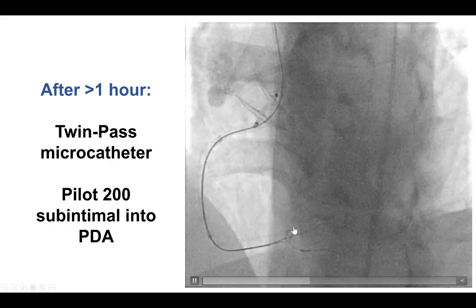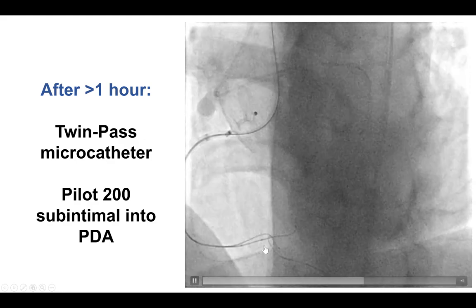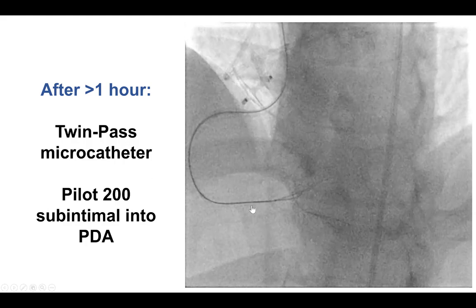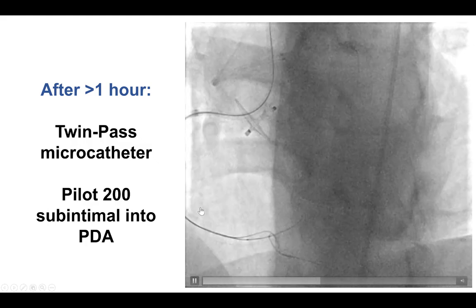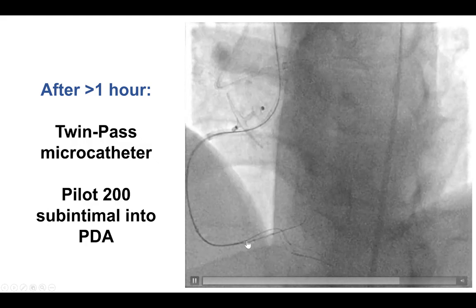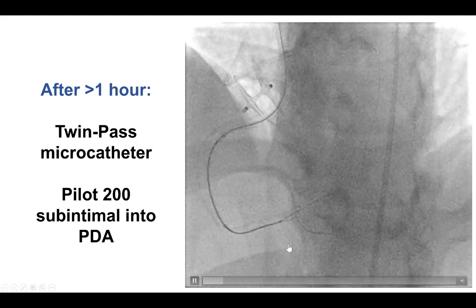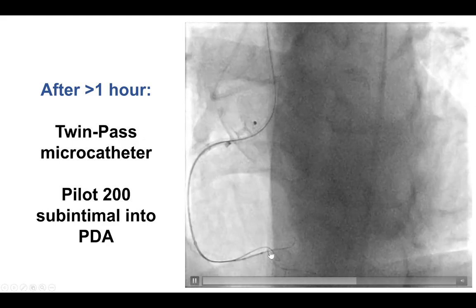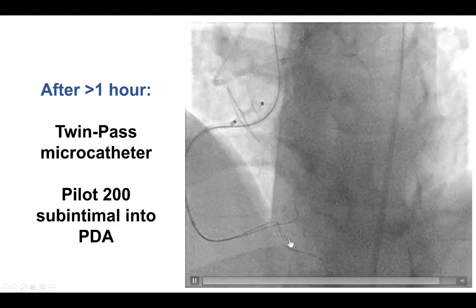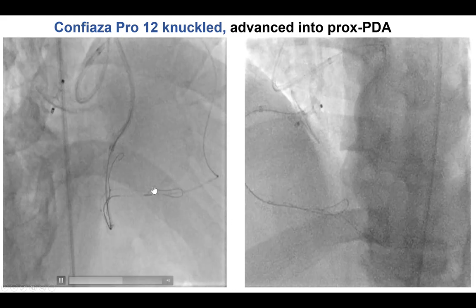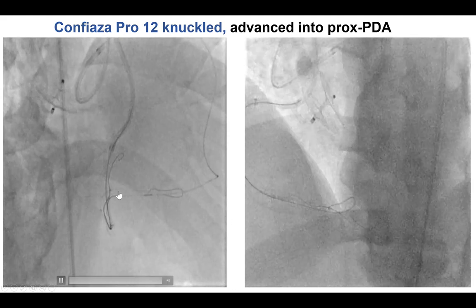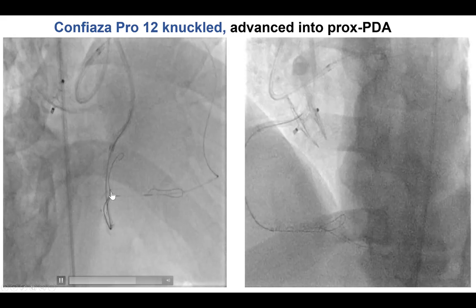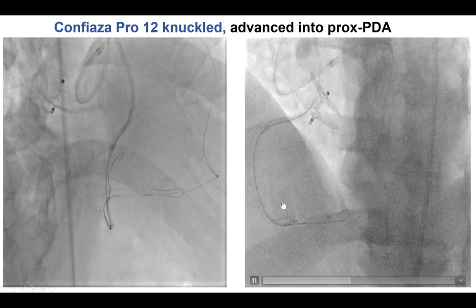We spent quite a long period of time. We tried both going retrograde into the distal RCA and antegrade, and after more than an hour of attempts, eventually we advanced a dual lumen microcatheter — a Twin Pass — through which a Pilot 200 finally went subintimally into the course of the right posterior descending artery. There appeared to be some significant tortuosity at that point. After doing that, the modified connection between the distal RCA and the PDA allowed us to advance a PRO-12 to the distal right coronary artery.